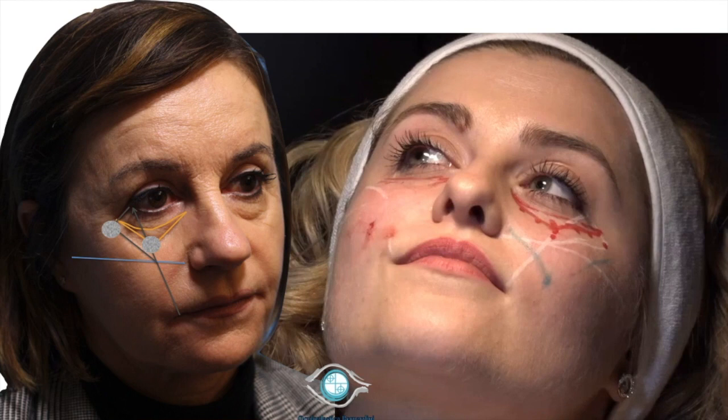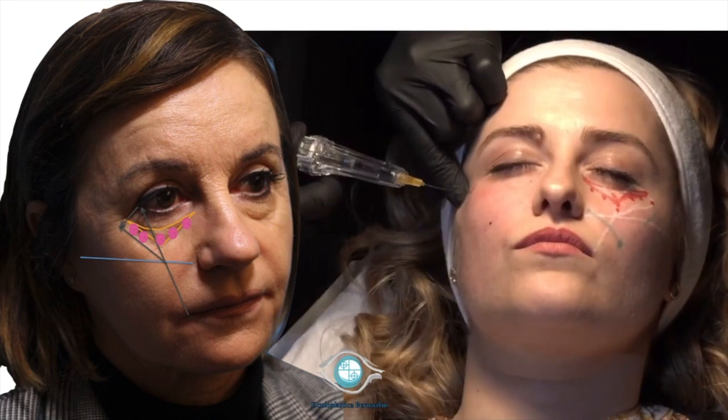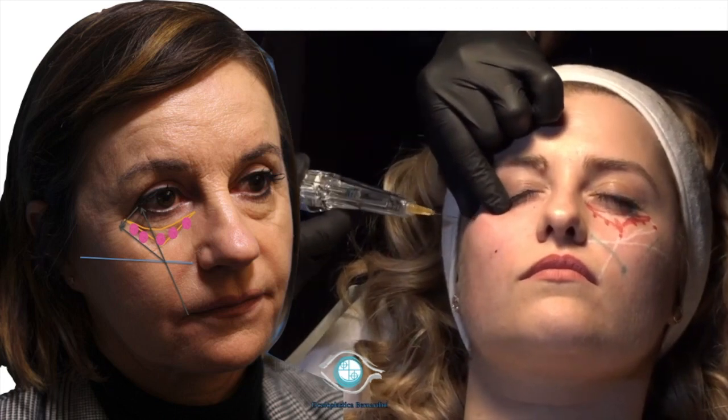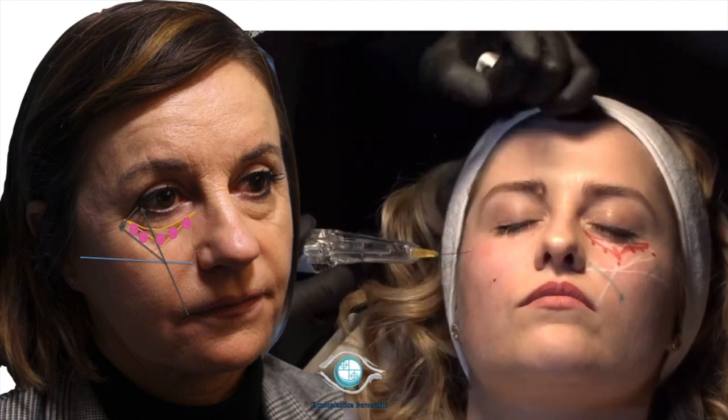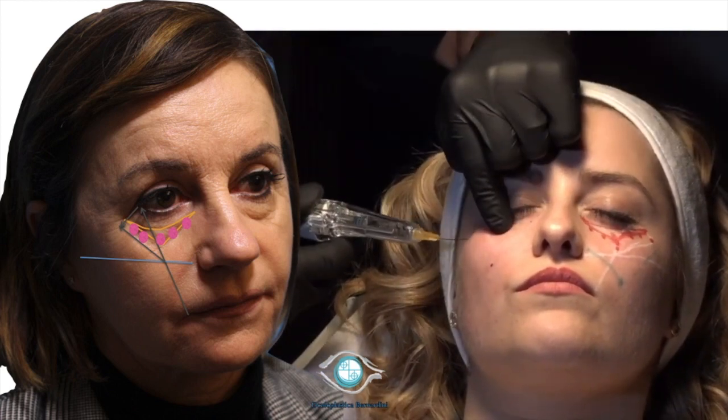We then switch to a low G' filler to treat the entire orbital, infra-orbital area. Again, a different entry point that is in this case determined by the G-point itself.